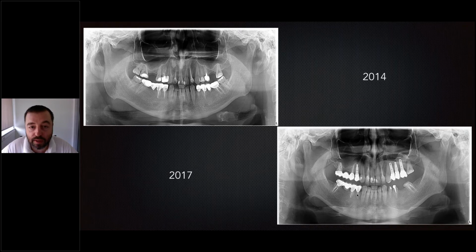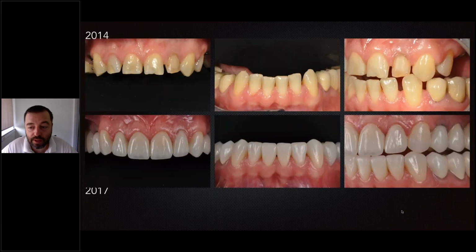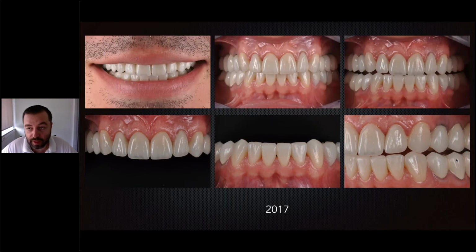And now clinical situation. Of course, also from aesthetic point of view, it's a very nice outcome. We have the function, we have everything. Here are our implants, and we can see it's an emergence that is going straight from the neck of the implant. This is something that is available for the tissue level implant, that the crowns are cemented directly on the neck of the implant. So again, this is the final restoration and the canine guidance here that is going to protect everything, and this is a 1 year follow-up. Everything is in place.